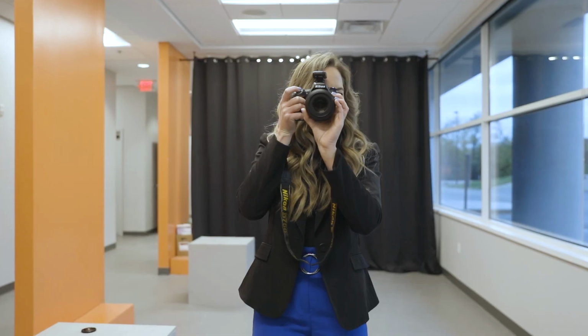From there, we take a lot of photos. We start looking at the patient, their smile line. Where does their lip line end right now? We want to see where that prosthesis is going to end up so that we can always hide the transition between the prosthesis and the tissue, so that when you smile real big, you don't see this. We want it to look very natural, very aesthetic, and I don't want people asking questions about it, thinking it's not real. From there, we start the design process.